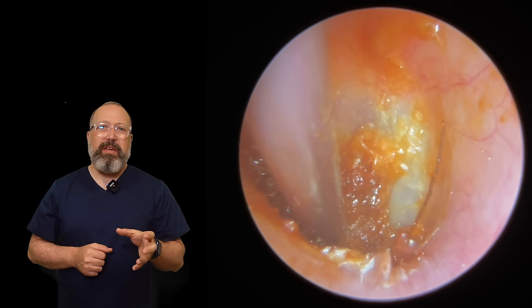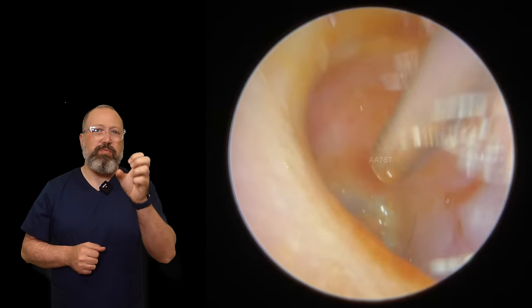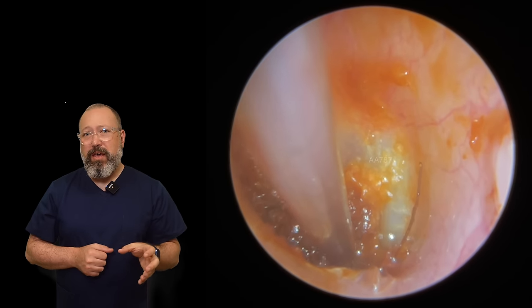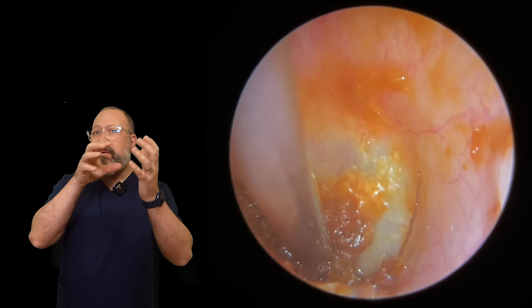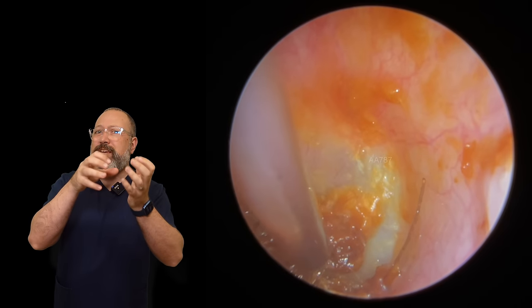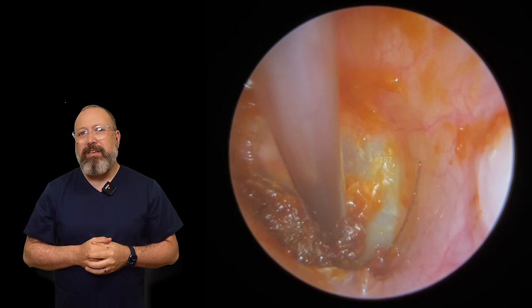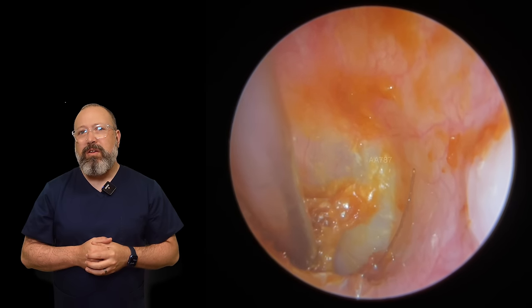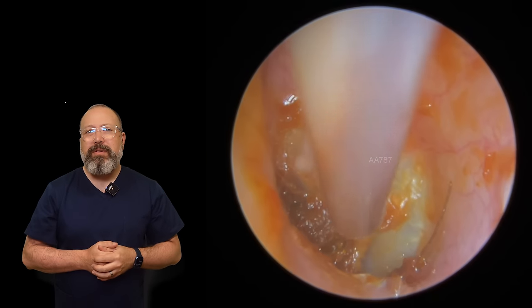It's very difficult to remove so the first thing we've done is switch to the fine end, only taking smaller pieces off. I've added some more olive oil just to encourage this to come off the eardrum because it's super sticky. We're working our way down in the anterior recess. Watch how it hovers just above and jumps off the eardrum — we're not actually touching the eardrum, just hovering just above, allowing the wax to get sucked through. It really doesn't want to come away easily, but it is getting there.